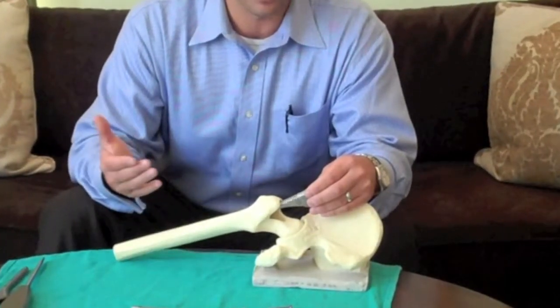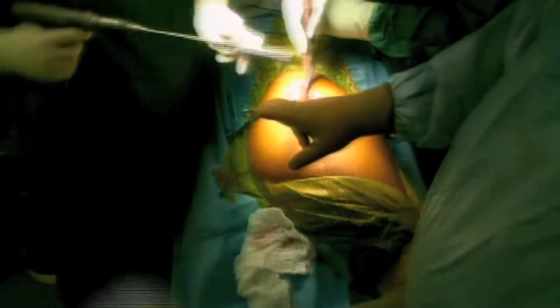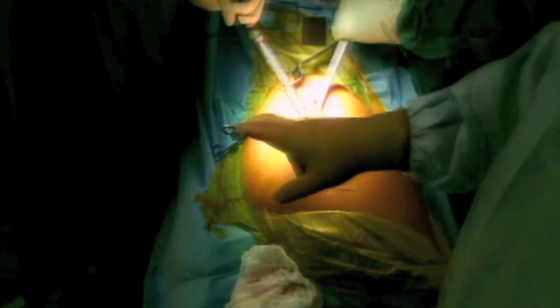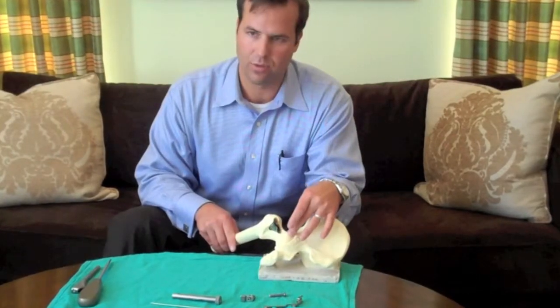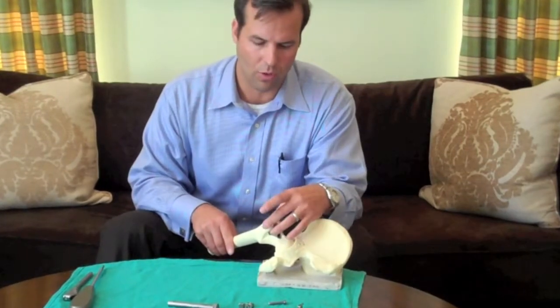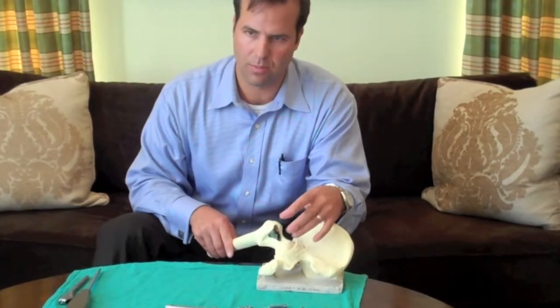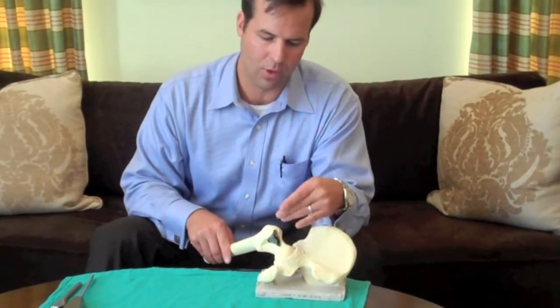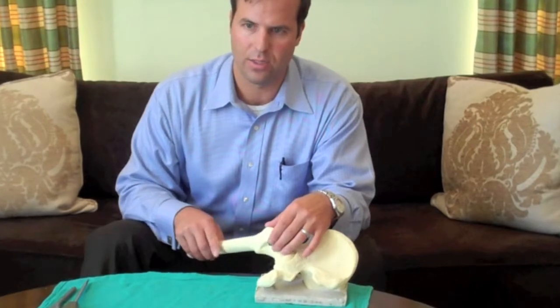It was designed to perform a hip replacement without ever dislocating the hip. In order to do this, the leg is adducted, flexed a little, and then it's a straight shot down the femoral canal. The femoral head remains in the acetabular socket during the broaching and reaming of the femur, so the whole femoral bone is stabilized during preparation. The intact femoral neck also preserves the femoral offset, which makes entering the femoral canal a lot easier.